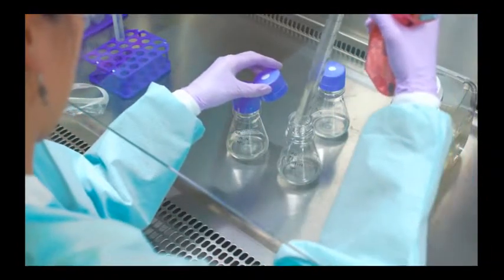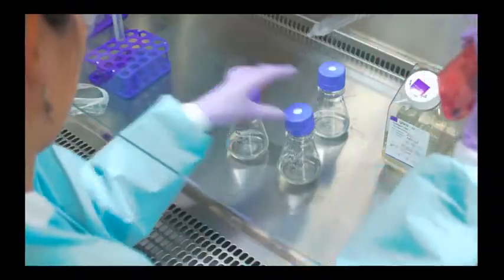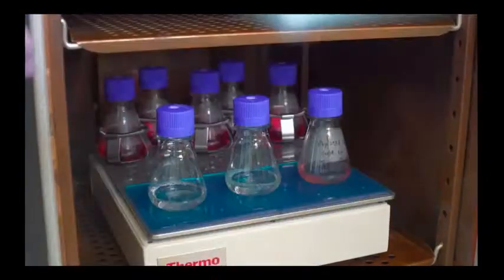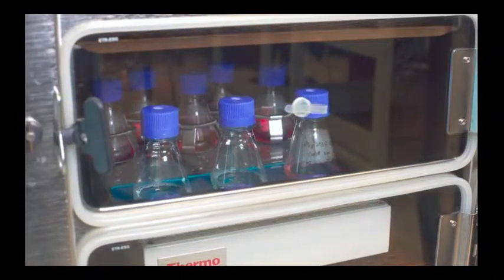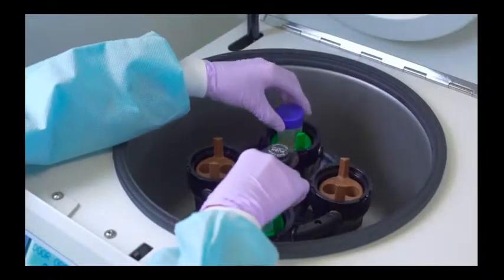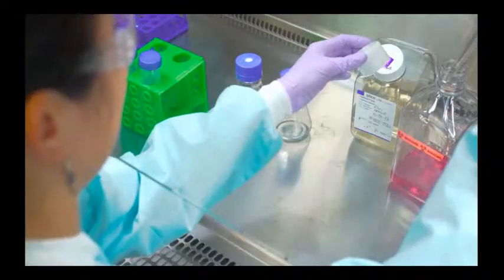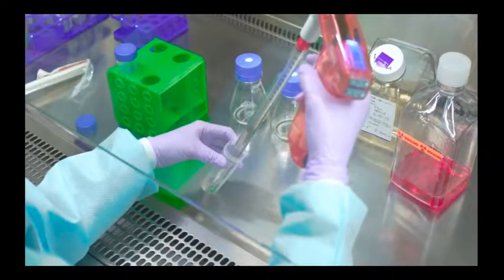You may need to split the culture into multiple flasks. Cap the flasks appropriately, depending upon whether they are vented or not, and return them to the incubator. Every 3 weeks, gently spin the cells, remove the medium, and replace with completely new medium. This eliminates cell debris and metabolic waste.